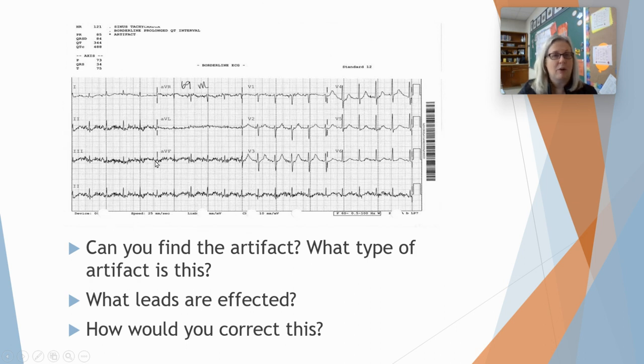They have tremors. Maybe they're wiggling too much. Maybe their hands shake. But this is tremors. Okay, and maybe they're just tense. They're tensed up their muscles, and because they're scared and worried, that happens too. Okay, so the leads that are affected are 2-3 and AVF.